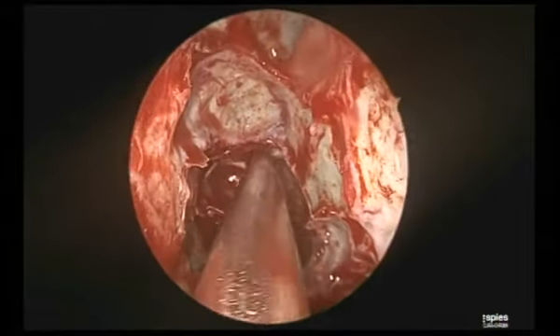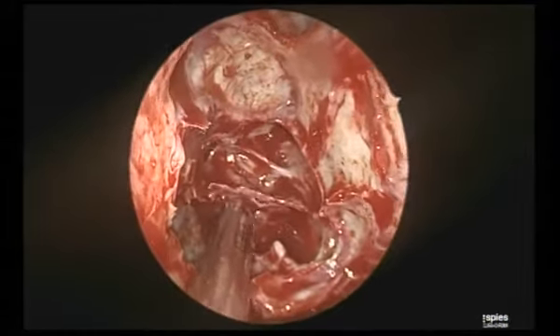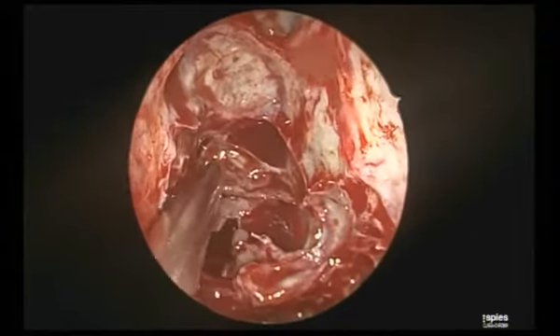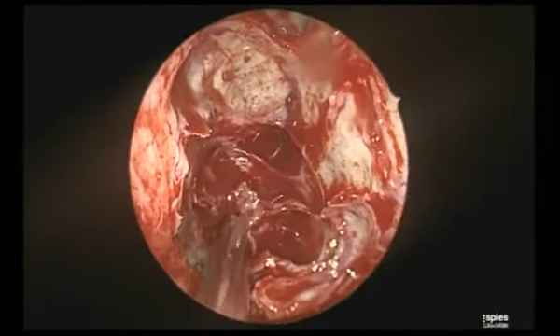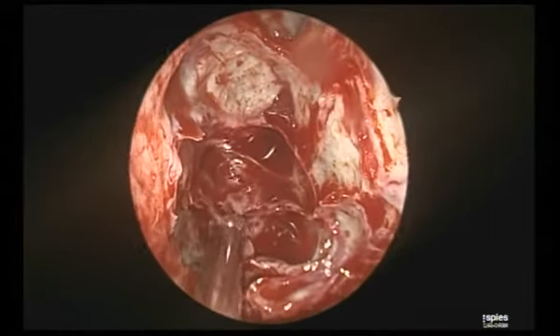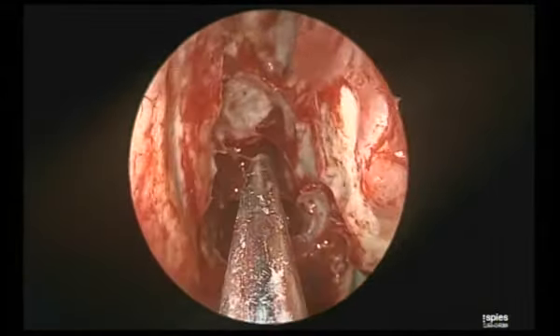Okay? See, here I am using it as a sucker. He has stopped the debriding mode. Sometimes I only use it as suction, now like a probe. Now he's cracking it. So the debrider is a versatile tool. All the time during surgery, the single most important tool for me to work is the micro debrider. And for the micro debrider to work optimally, the only thing required is a good suction backup. It can ruin your blade and ruin your motor if the suction backup is not good.